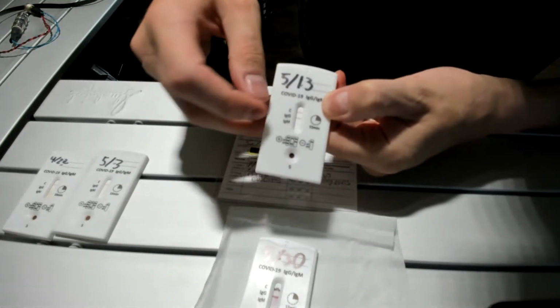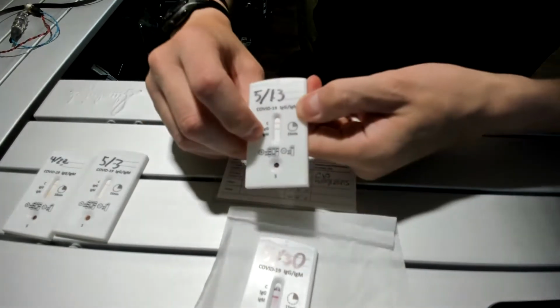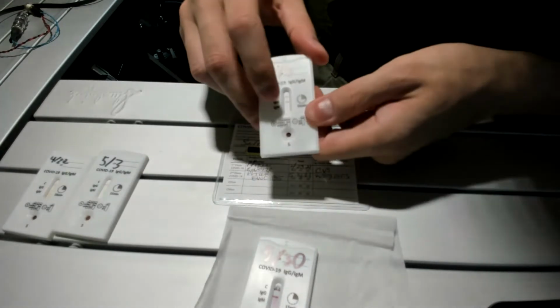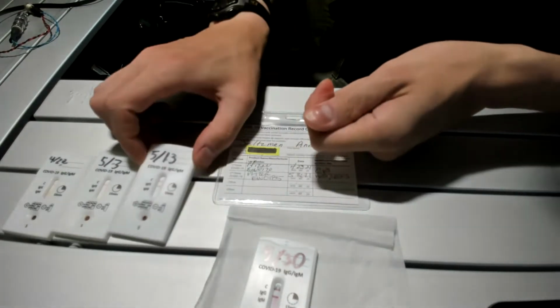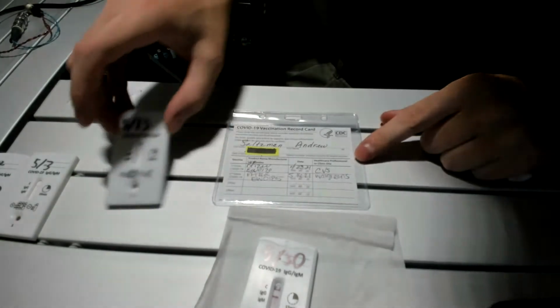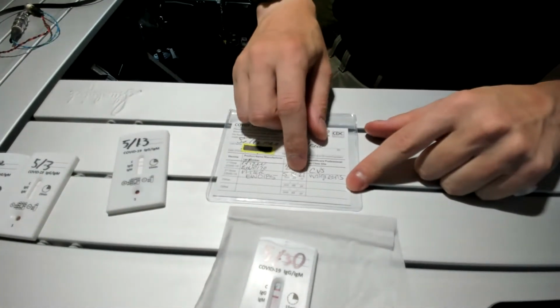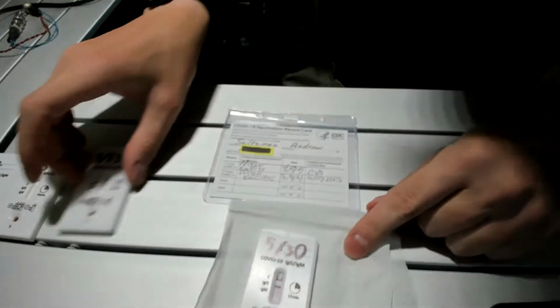And on the IgG, you can see a fairly dark line. The IgM line is very faint. So I probably missed the IgM antibodies. So that was 2 weeks out. So then that was on 5/13. On 5/16, I got the second dose of the vaccine, and now it's been 2 weeks from that second dose.